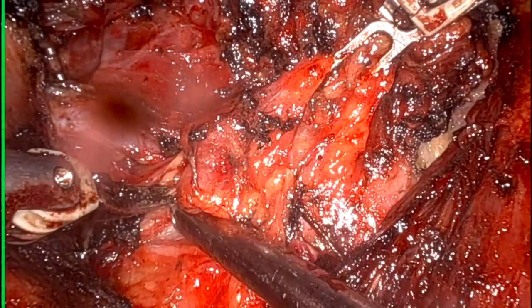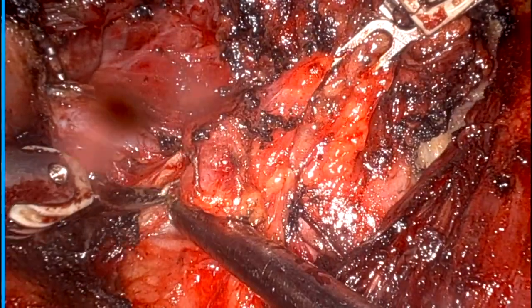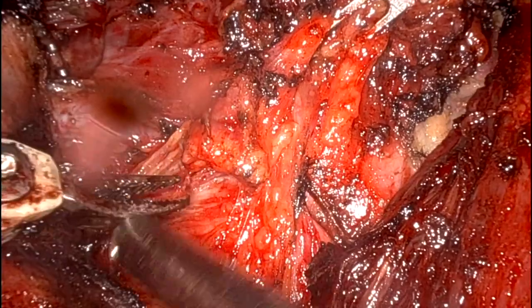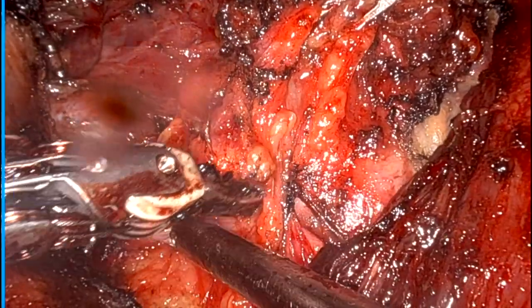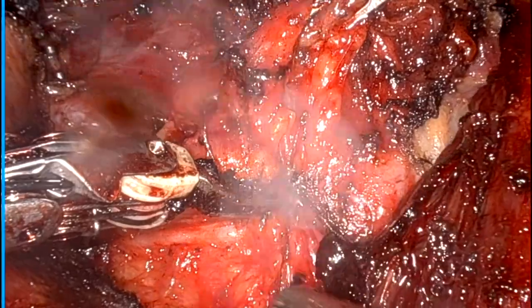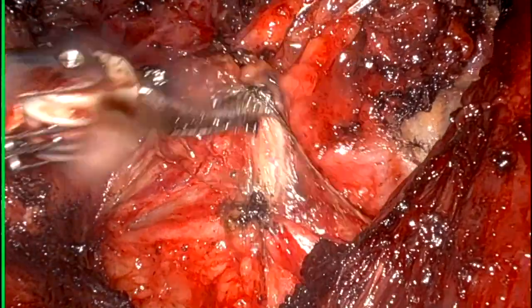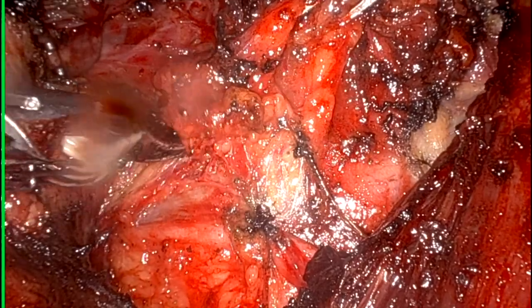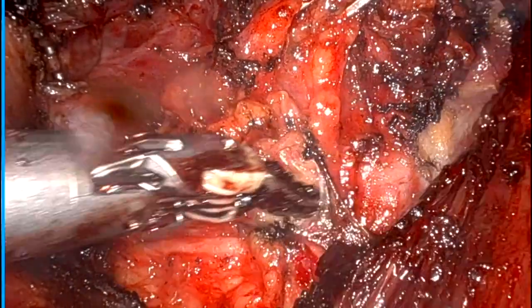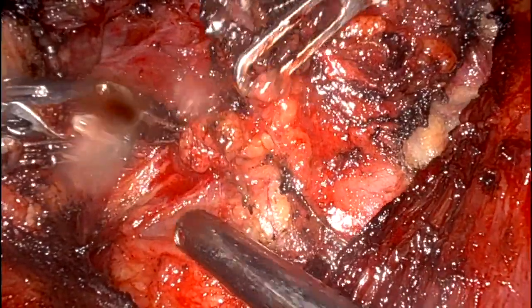So we got the nerve just below my suction. You can see spinal accessory nerve. You can see it better. I am taking the tissue anterior to spinal accessory nerve. That will be level 2A.